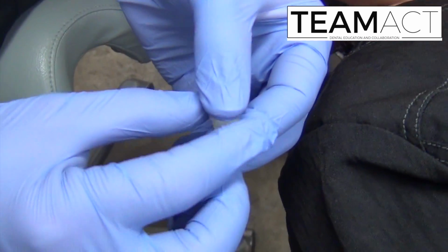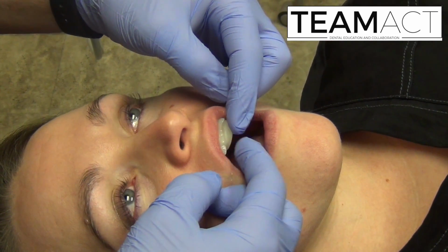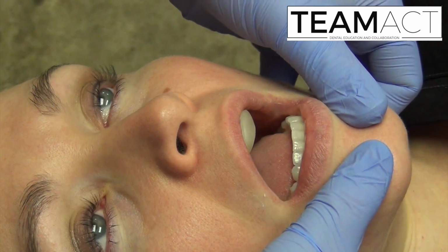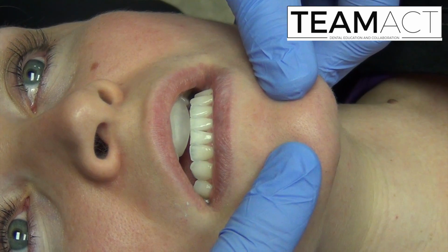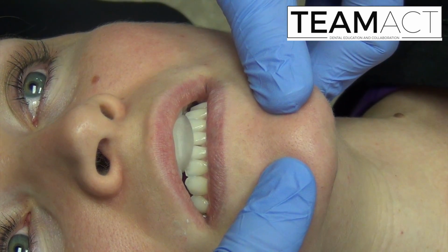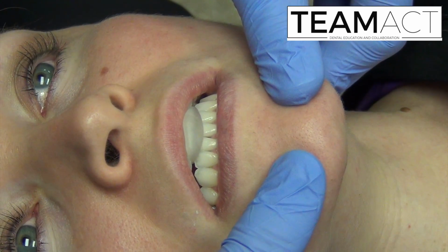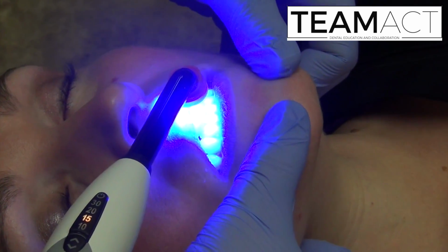I'll demonstrate using a Triad Jig, a technique that eases the recording of centric relation using bimanual manipulation. We adapt the triad to the anterior maxillary incisors. Properly supporting her mandible, we instruct her to close slowly into the triad until she has about 1.5 millimeters of space between her teeth. This is repeated several times to confirm its accuracy, and then we use a light curing unit to cure the triad while in her mouth.